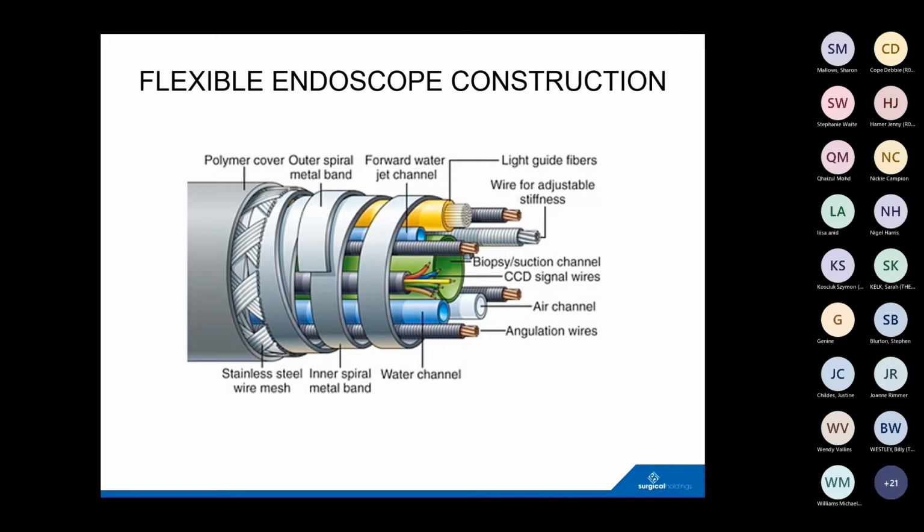and you have the distal tip of the instrument in a sort of J loop, then clearly there's bends in it, and as you're passing that needle or laser fiber towards that, it will hit the wall, and if it's sharp, it can then potentially go through that wall, and you've then compromised the internal structure of your instrument that way. So we'll come back to that later, but the principal thing to remember there is it's very complicated internally, and if you get fluid in there, it's not good.